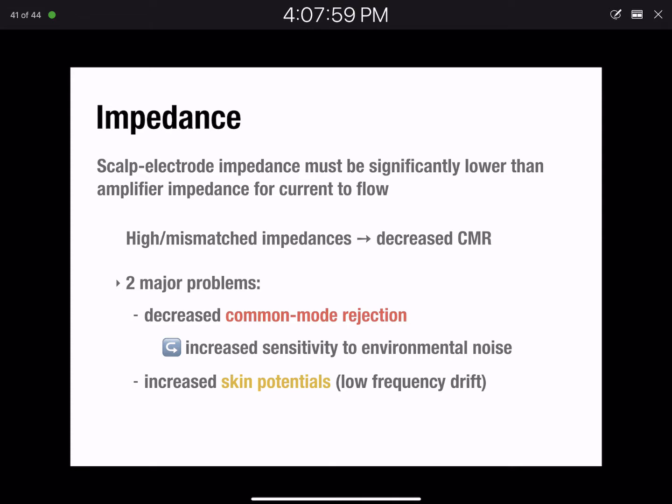signal-to-noise ratio. So the noise in the environment, you can kind of control your environment, but once you've controlled it, you have some baseline level of noise, and that's going to get picked up. And so then it's how strong can we get the EEG signal relative to that baseline level of noise. So the lower we get the impedance, the more we're going to improve our signal-to-noise ratio by boosting the amount of signal, noise being sort of the constant.